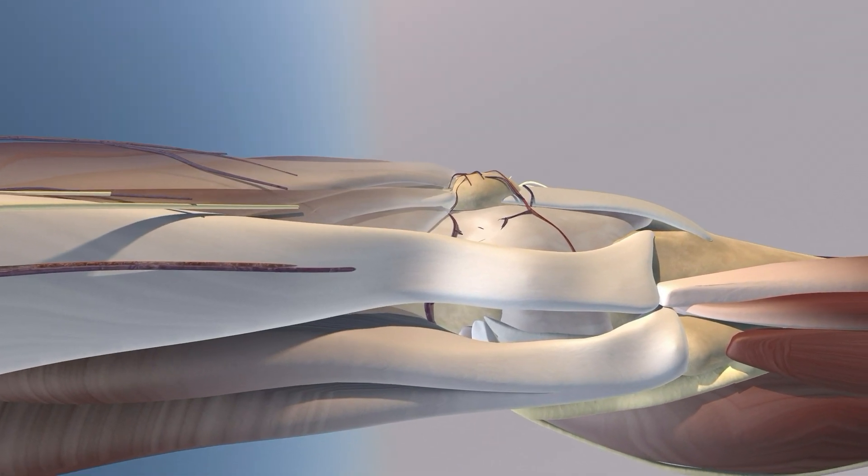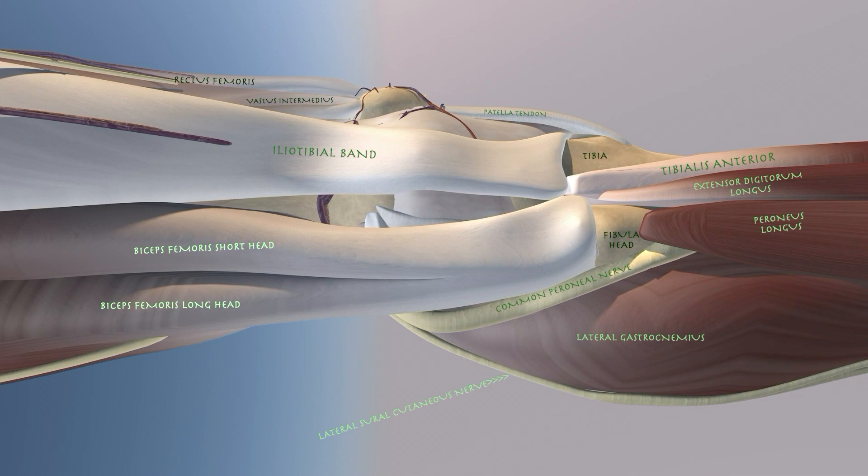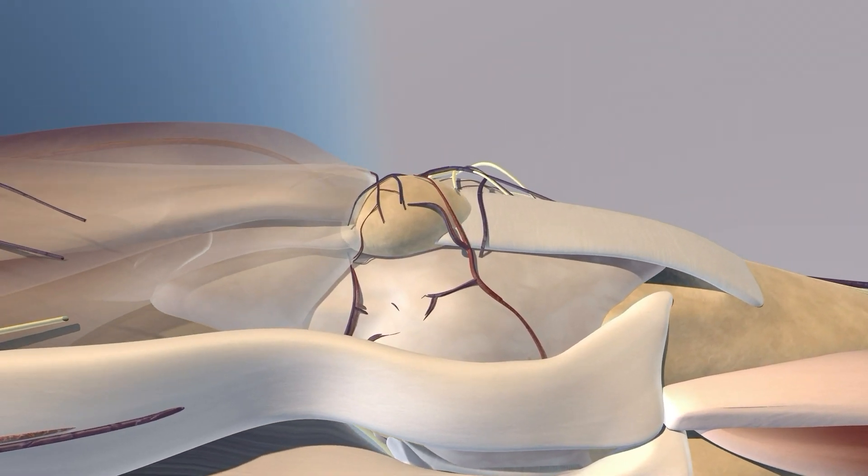Essentially, you want to go about one inch or so proximal to the patella, then drop your finger down to that anterior margin of the iliotibial band. You're going to put your needle right above that anterior margin and angle your needle a little bit distally, going essentially straight into the knee joint.